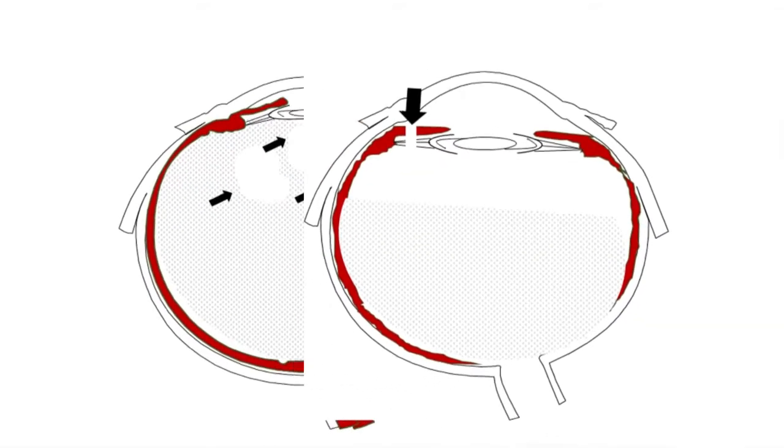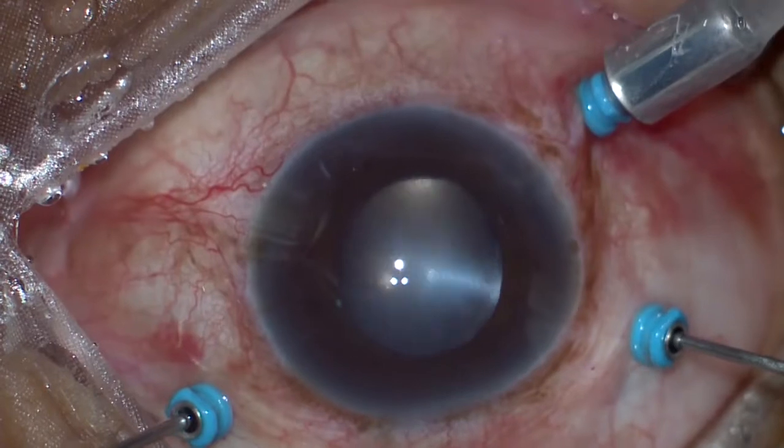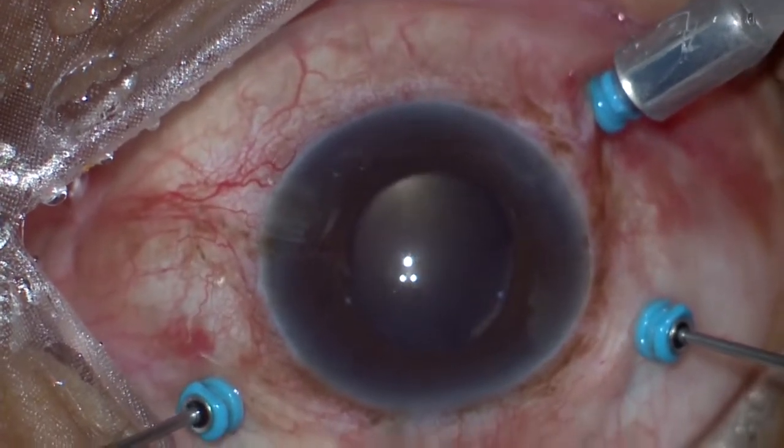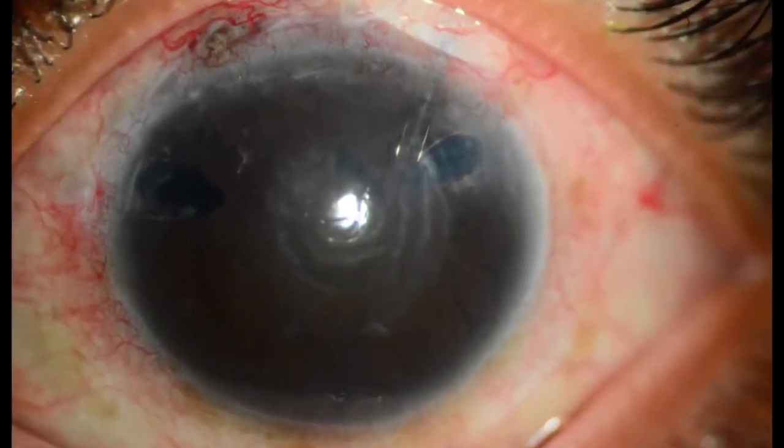The aim of the surgery is to convert the eye into a unicameral chamber. Up until now, the standard surgical procedure of choice is pars plana vitrectomy with lensectomy if the patient is phakic. But recurrence is not unknown.